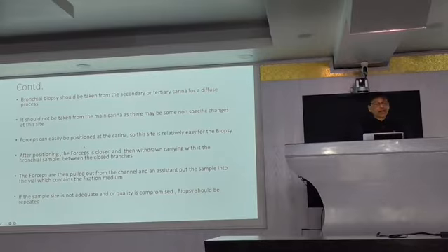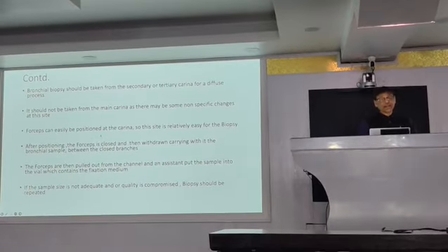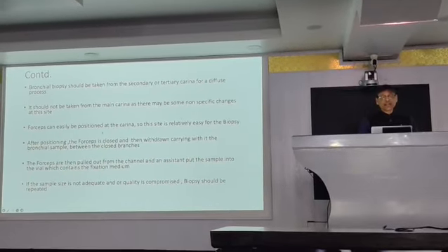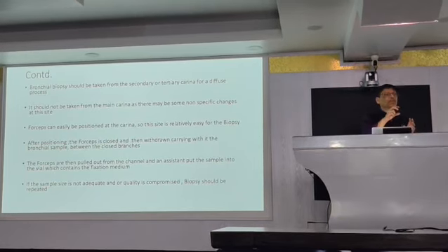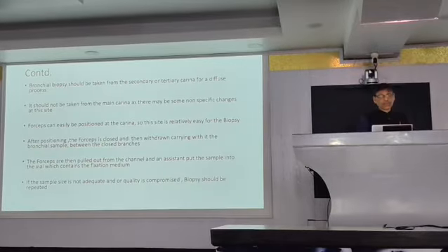Forceps can easily be positioned at the carina. So this site is relatively easy for the biopsy. You can easily fix the forceps at the carina. It is sharp, so it is the better site.